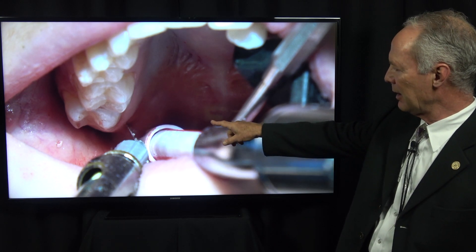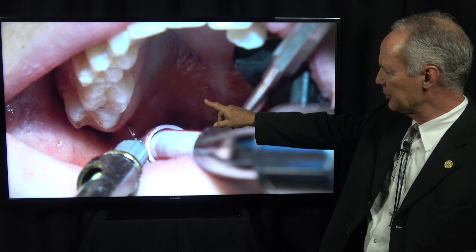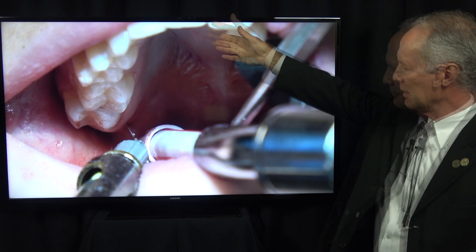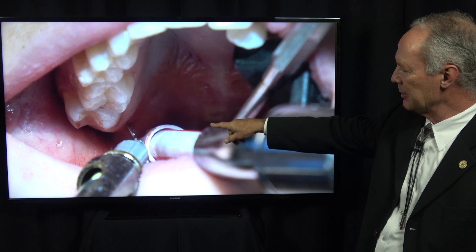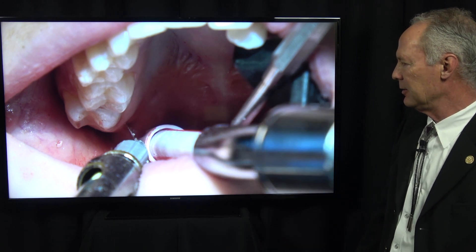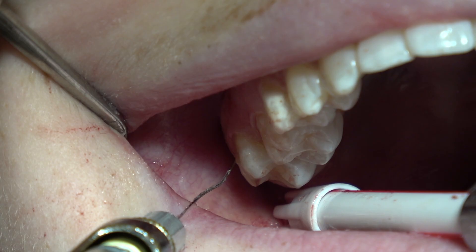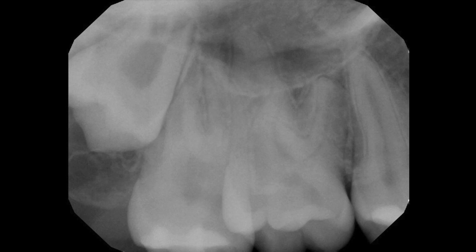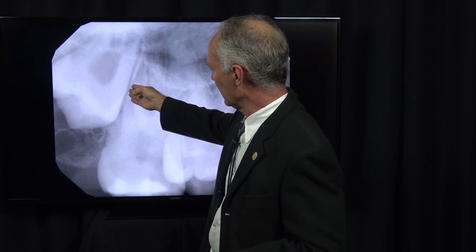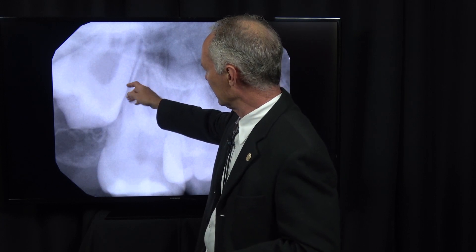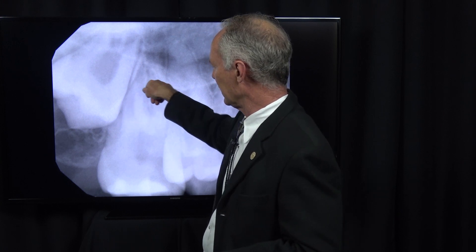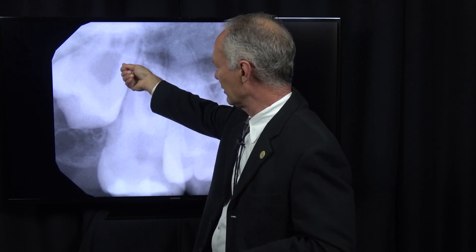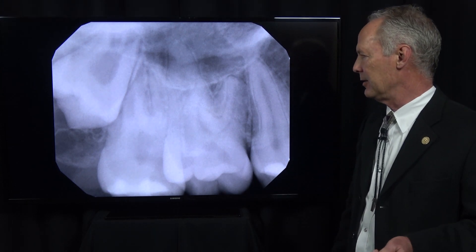Now this is the maxillary right wisdom tooth. I've already given infiltration anesthesia, and now I'm giving an intraligamental. If you don't give the intraligamental, there will be discomfort. I'm giving it on both sides. I'm going to place a periosteal elevator here and just torque it slightly to create enough space to place the E301, and then I'll be able to roll that wisdom tooth right out of there.